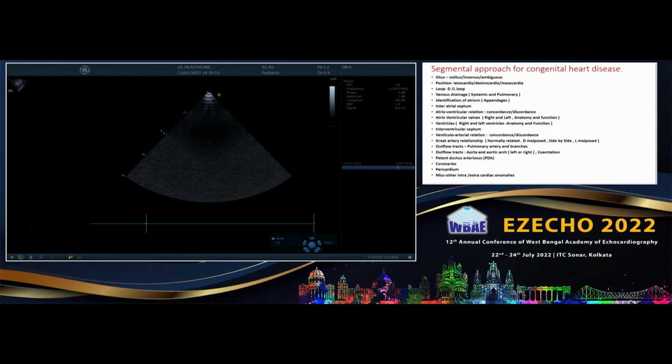Live demonstration of the case, whatever it comes. Wherever we go, we can stop. There is no end of learning, sir. I completely agree. So whatever we have learned, we should know completely rather than a little bit of everything. Let us have the babies ready because changeover time is too much.